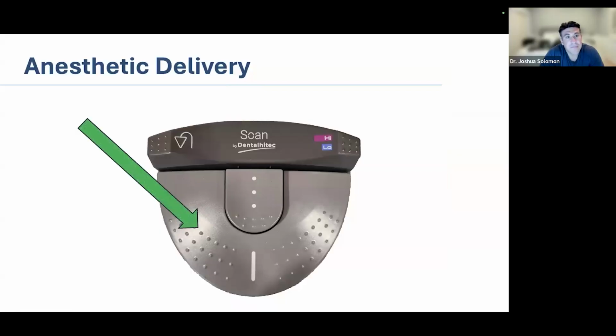There's one other advantage there, and I think that's an important point that Anne made as far as stepping on the pedal ahead of time. That's also one of our check steps because these units do work wirelessly, and our chairs are so thick of metal and plastic and rubber and everything else that, for your SOAN specifically, if your pedal is way under your chair, it may not talk to your SOAN. And I want you to make sure that the thing's communicating before you start poking into soft tissue. So there's a double added benefit of doing exactly what Anne just said.